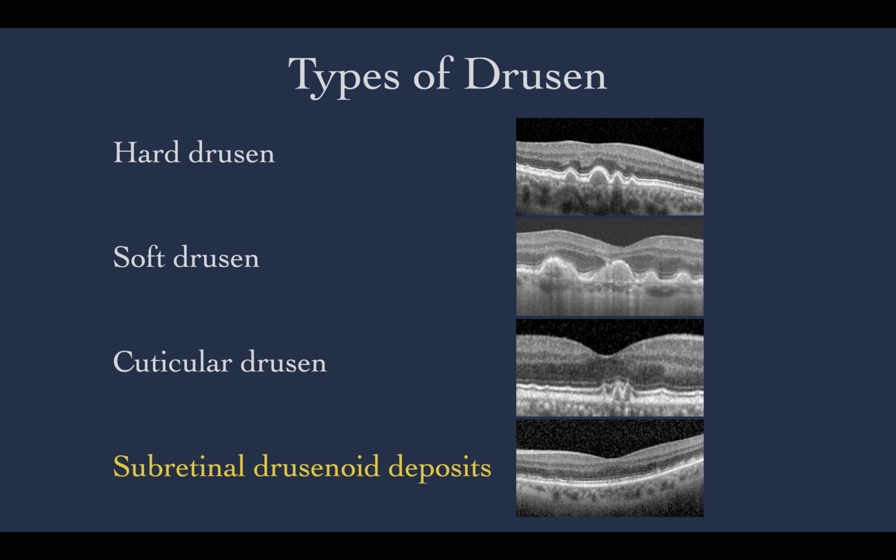The fluorescein angiography findings of subretinal drusenoid deposits are subtle, ranging from no change to minimal hypofluorescence. By OCT or histology, subretinal drusenoid deposits vary in shape and thickness above the RPE, appearing as conical or flattened and as hyperreflective lesions on OCT. Subretinal drusenoid deposits can be large enough to disturb or shorten the overlying photoreceptors. They are associated with a reticular pattern of decreased autofluorescence.